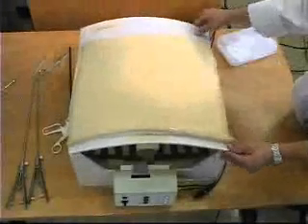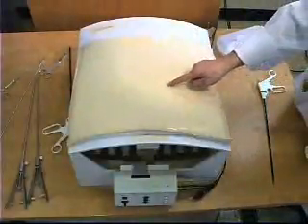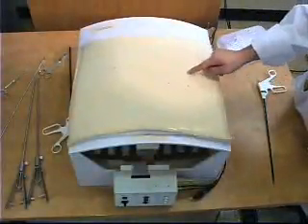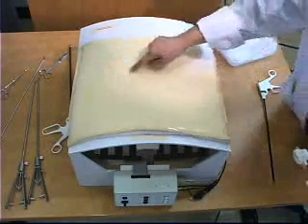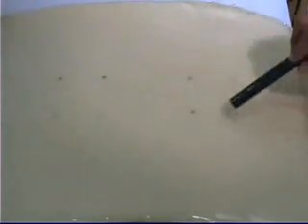The endotrainer box is covered with a simulated skin, which has 8 preset defects in it in which to place trocars. The operator may choose to place the trocars in any of the sites and may vary them according to the task, but the operator must also avoid placing trocars in such a way that they would interfere with each other.